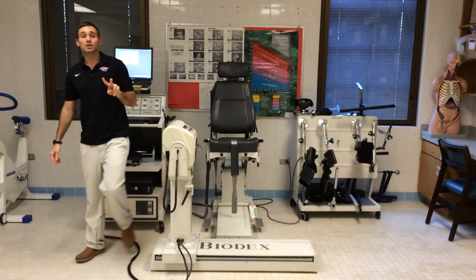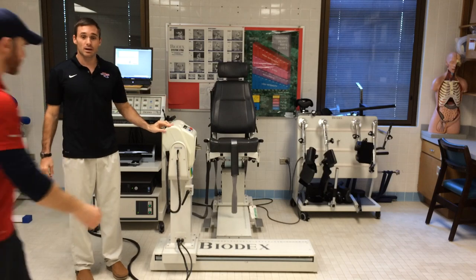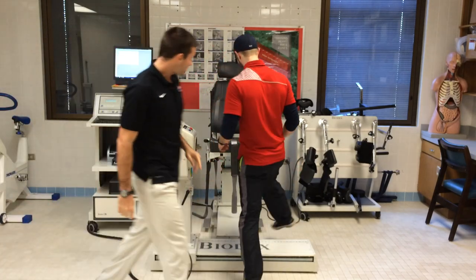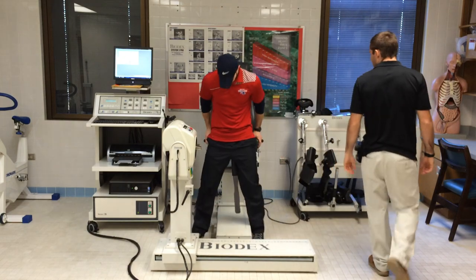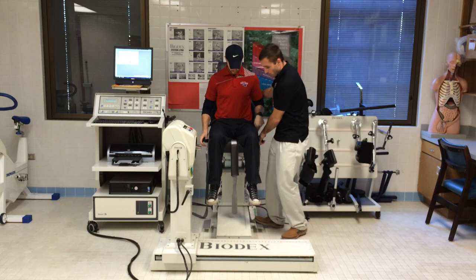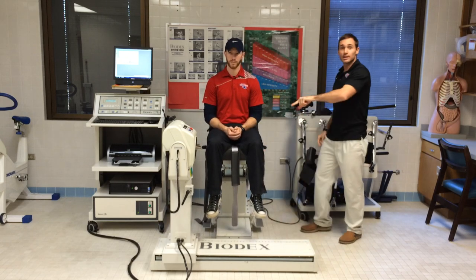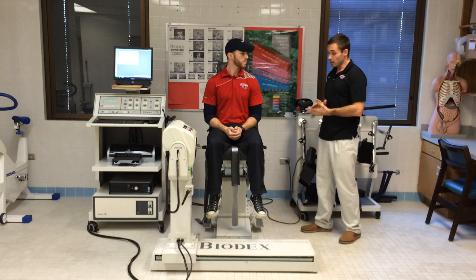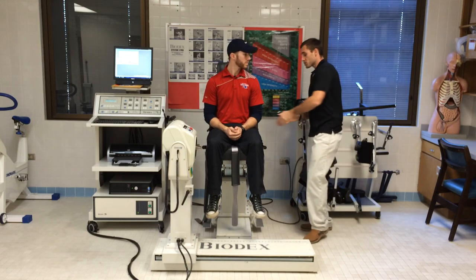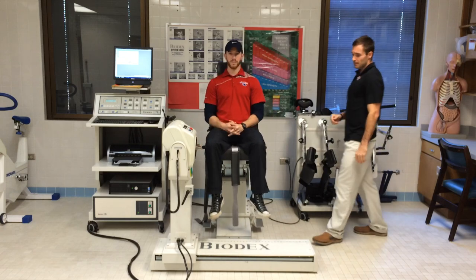Step two is to make sure we get the seat set up for our subject. So Bo, I'm going to have you take a seat right here on the chair. And before I do anything, I'm going to pull him forward a little bit, so that I have the ability to go around the entire chair, because there are things we're going to need to adjust. I want you to pull your hips all the way back in that chair for me, and I want you to just sit flat.